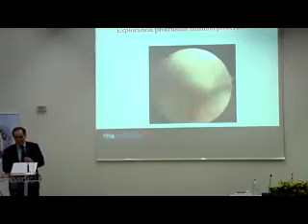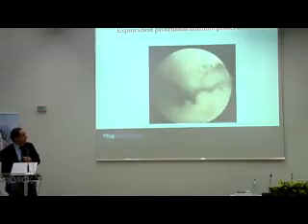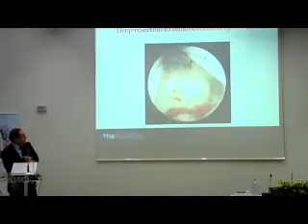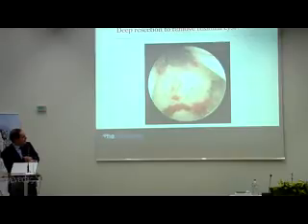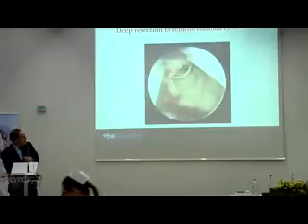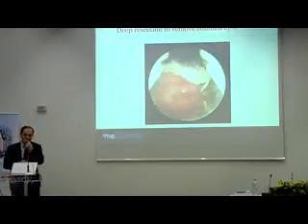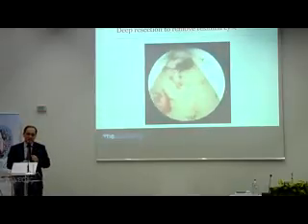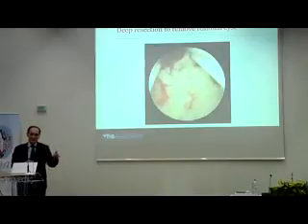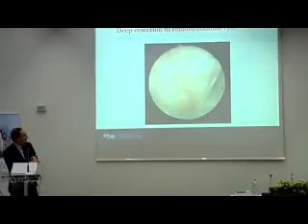And it has been shown by several publications that if you do not remove adenomyosis with drugs, you don't get the result you need for a healthy pregnancy. Now we take the resectoscope and we will resect. And this is real surgery. And we resect into the myometrium. It's still even more difficult because behind this area, there are cysts. So you have to find this.